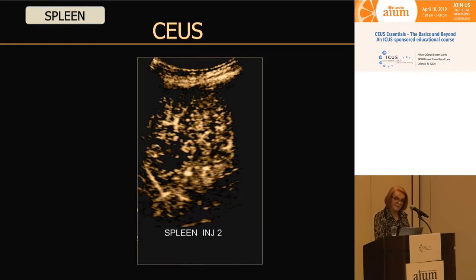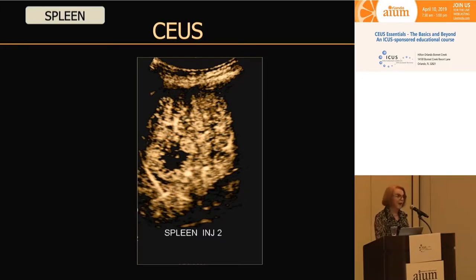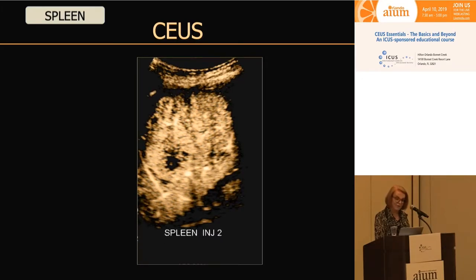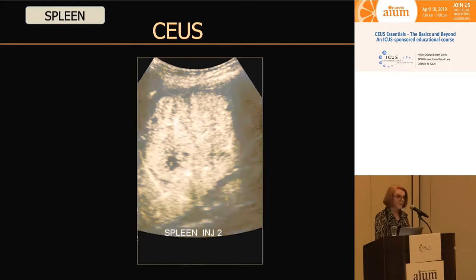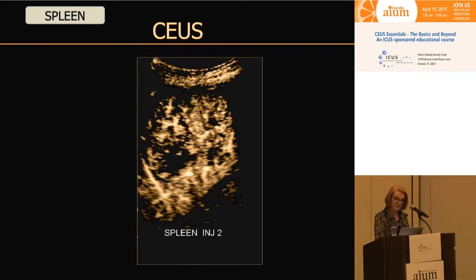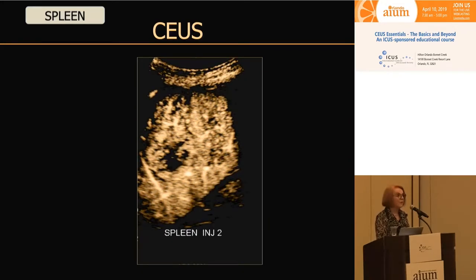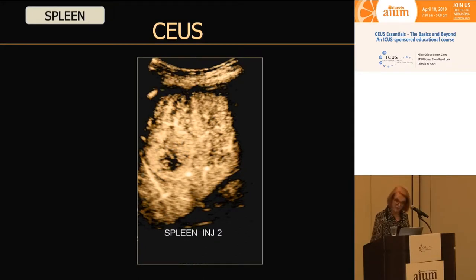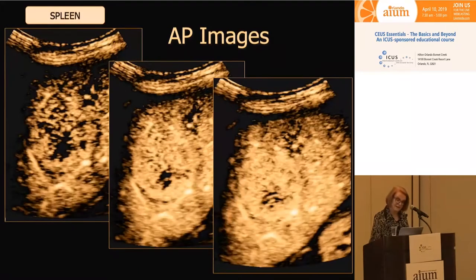On grayscale scan, I had no idea what this was beyond that it's a mass — a focal hypoechoic mass. We're always worried about hypoechoic masses everywhere, so we do a contrast ultrasound. You can see his spleen is very avid for the contrast, but the mass is also quite avid, filling from the periphery into the center. Looking at this, I thought I wonder if this is a hemangioma in his spleen.